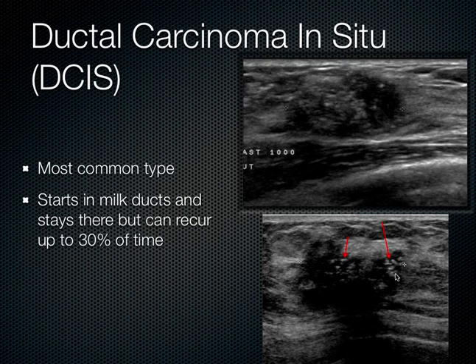readily these microcalcifications are seen here, and it's by far more common than the other type of carcinoma called lobular carcinoma in situ, and more importantly, it should be distinguished as a clearly malignant lesion, which these are. And so ductal epithelial cells basically undergo malignant transformation and proliferate intraluminally. Eventually the cells outstrip their blood supply and become necrotic centrally. This debris calcifies and is what is detected on both ultrasound and mammography.